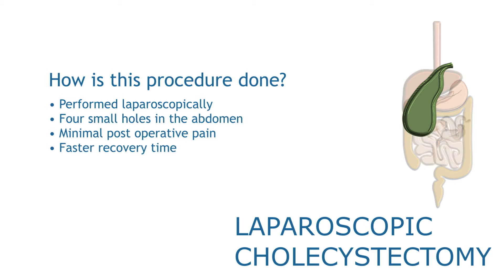The gallbladder is then freed of any scar tissue which may be present from previous episodes of acute cholecystitis. A small incision is made either in the gallbladder itself or in the cystic duct to allow insertion of a small tube or catheter. Dye is injected through this catheter to allow visualization of the ducts and to ensure that no stones are present within the bile duct on an x-ray screen.